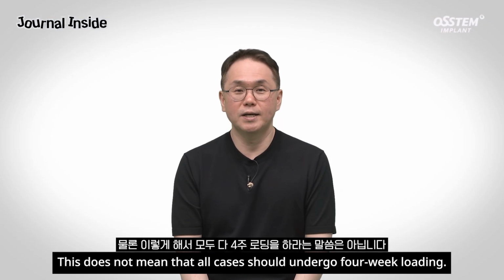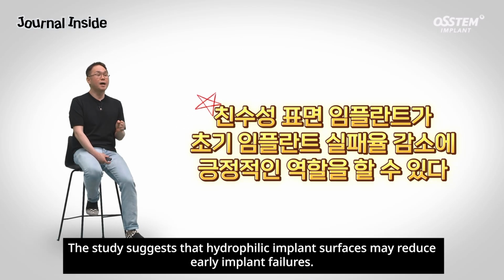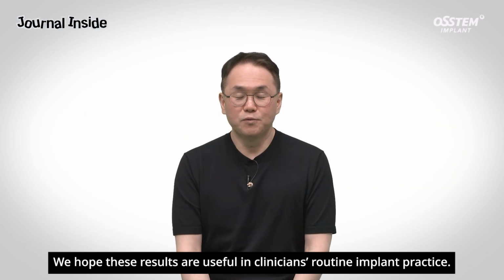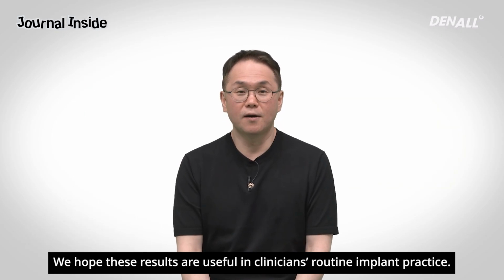This does not mean that all cases should undergo 4-week loading. The study suggests that hydrophilic implant surfaces may reduce early implant failures. We hope these results are useful in clinicians' routine implant practice.